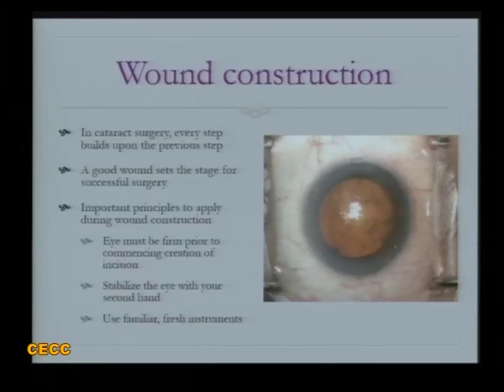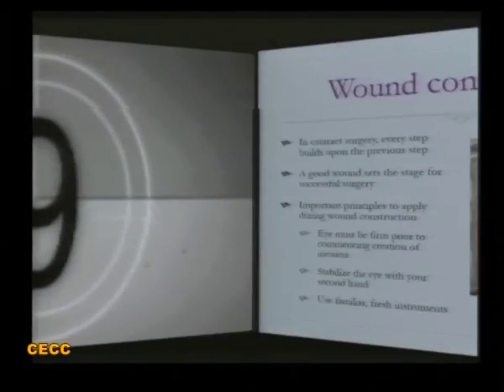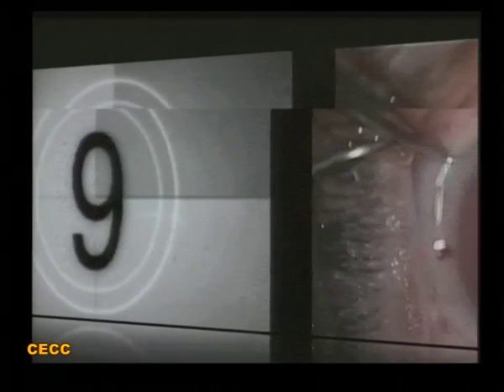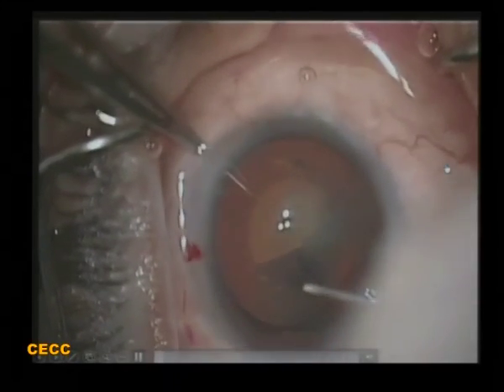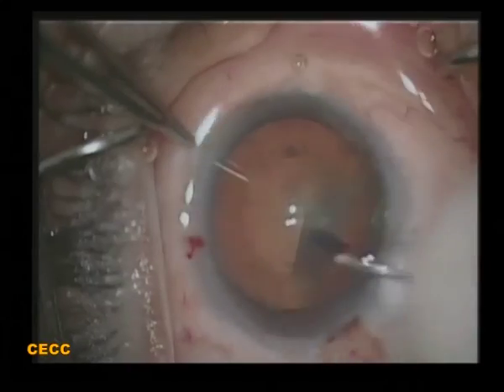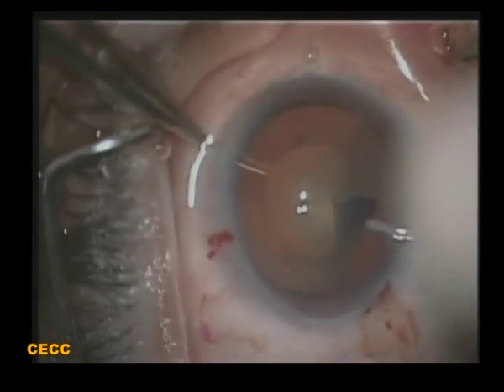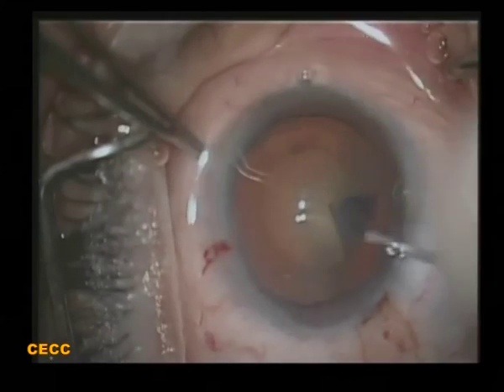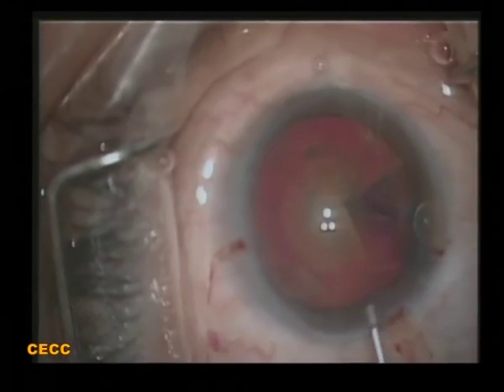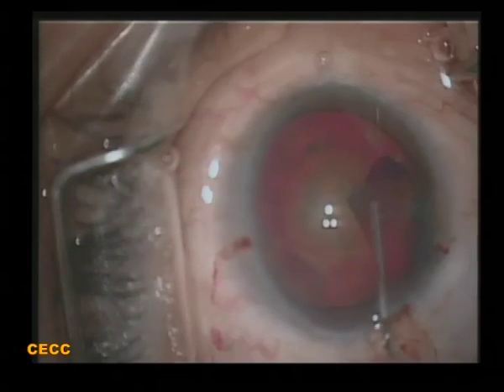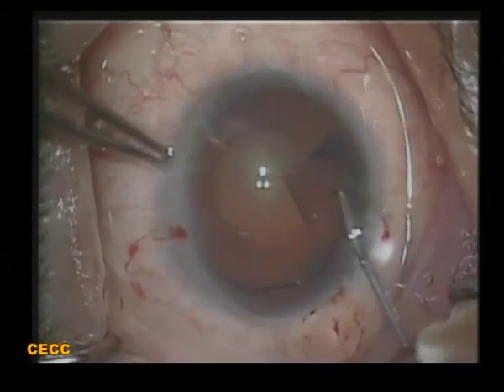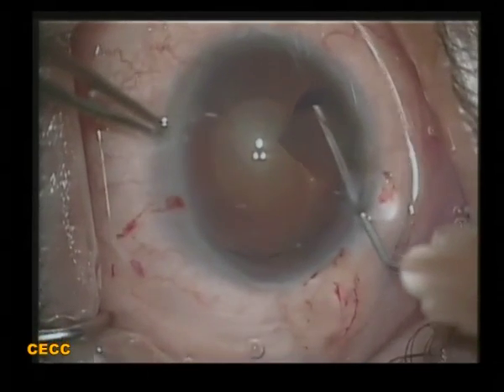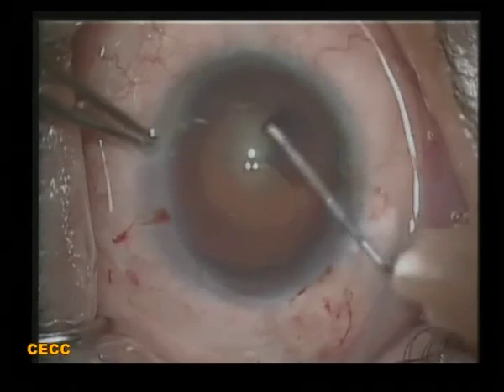This is the mistake I have seen done the most number of times by young ophthalmologists, and it sets up a bad case henceforth. In the second case — a grade 4 cataract — we stained the anterior capsule and are trying to do the capsulorrhexis using a cystotome, changing direction each time. The chamber becomes slightly shallow, we refill with viscoelastic, but the rhexis flap has not been turned back onto itself and the rhexis starts going outwards.